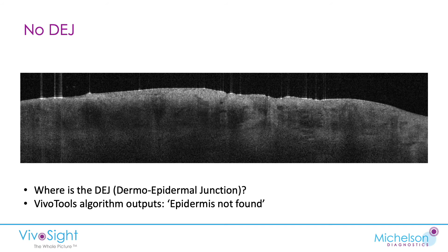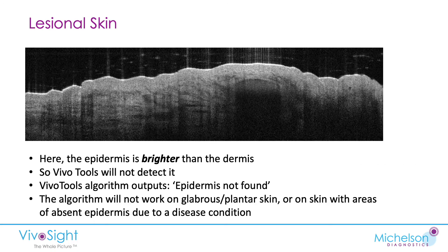Here's another example of lesional skin — probably an eczema of some description. We can't see any DEJ, and the VivaTools algorithm outputs 'epidermis not found.' There's a similar story on lesional skin when the epidermis is actually brighter than the dermis — VivaTools will not detect it and outputs 'epidermis not found.' The algorithm also doesn't work on other types of skin such as glabrous or plantar skin, or areas where there is absent epidermis due to a disease condition.